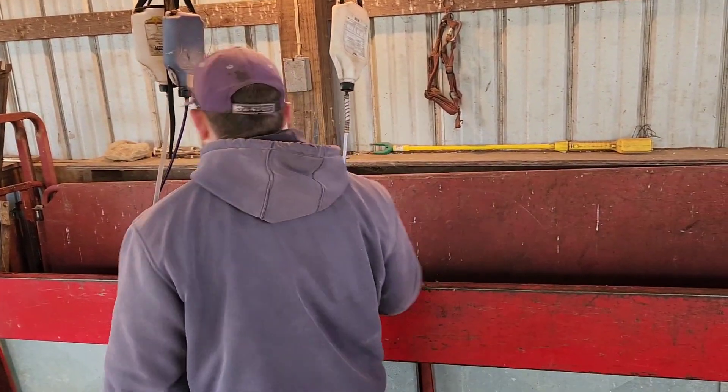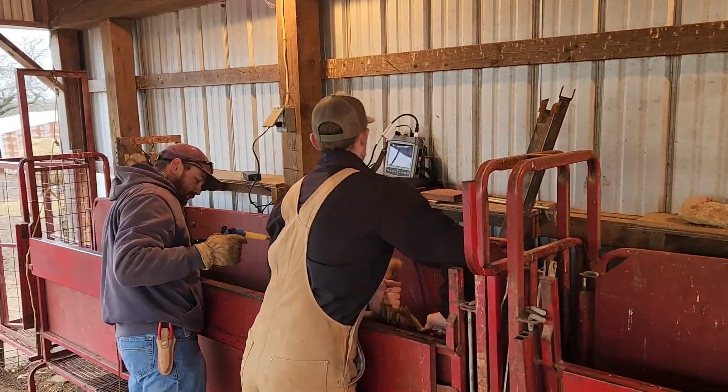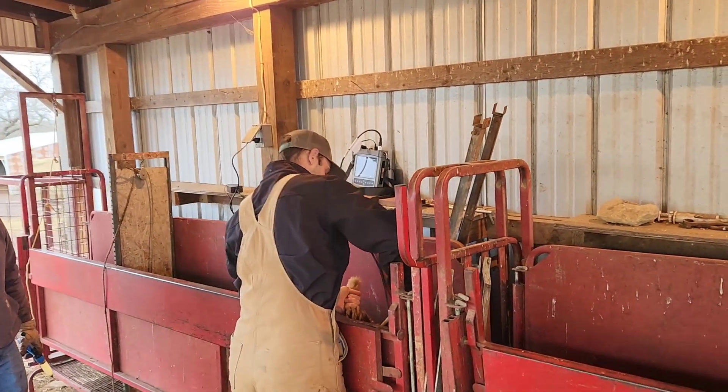Hey guys, if you've been with us before, you remember Wyatt, a vet student from OSU that came and sonogrammed our ewe lambs before — and here we're doing that again today.